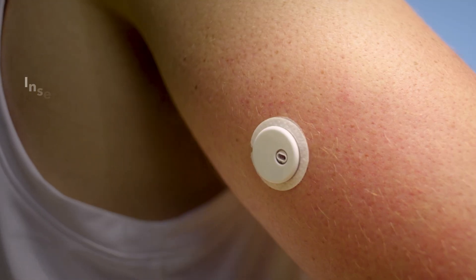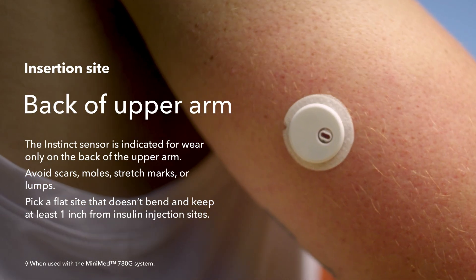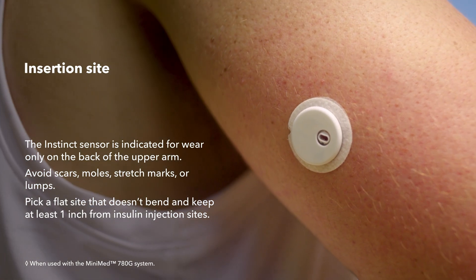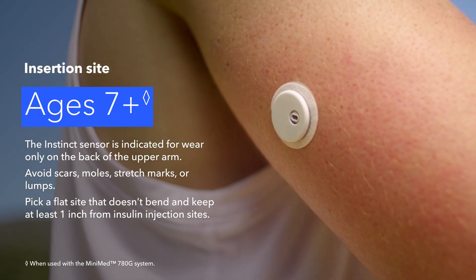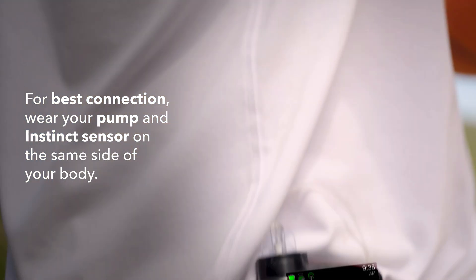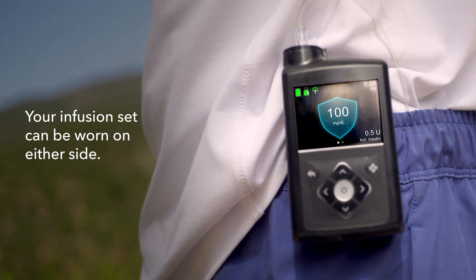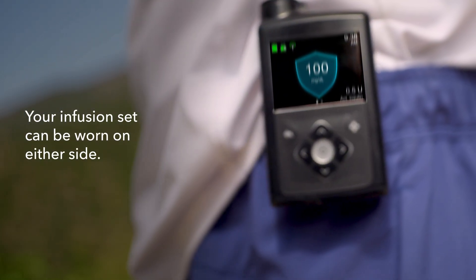The Instinct Sensor is inserted on the back of the upper arm and, when used with the MiniMed 780G system, is indicated for people ages seven and older. For the best connection, it's important you wear your pump and sensor on the same side of your body. Your infusion set can be worn on either side.